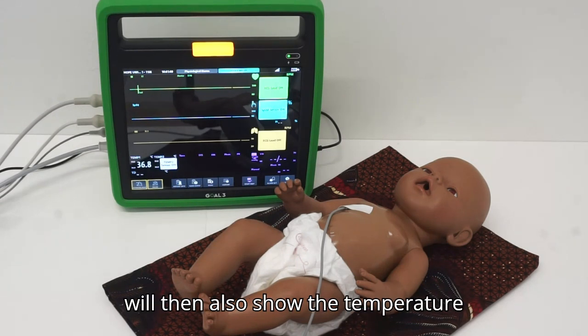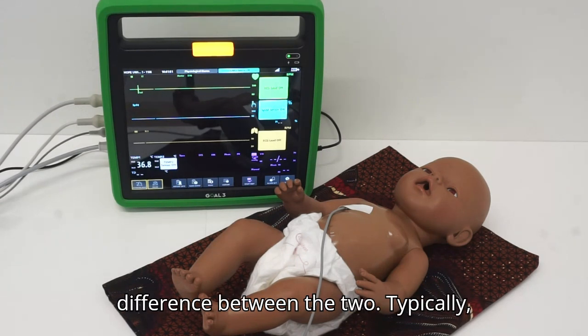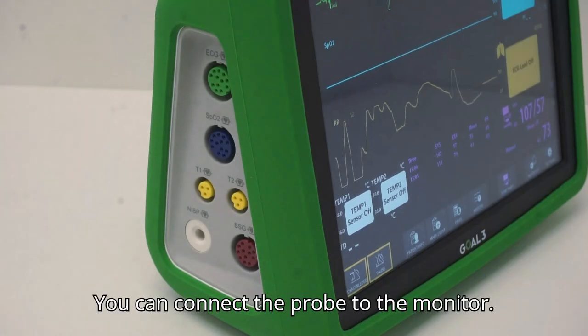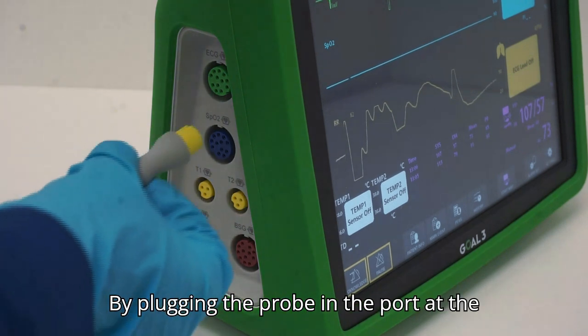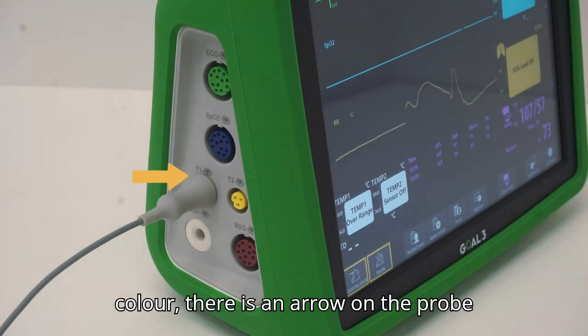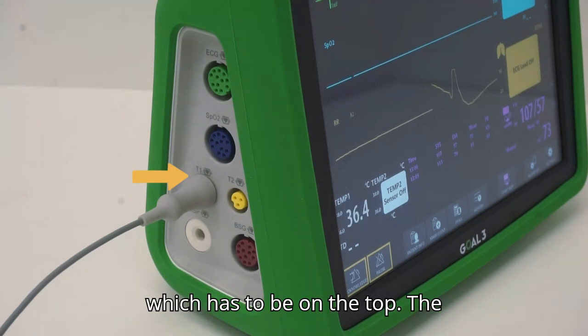The monitor will then also show the temperature difference between the two. Typically you use only one temperature probe. You can connect the probe to the monitor by plugging the probe in the port at the side of the monitor with the matching color. There is an arrow on the probe which has to be on the top.